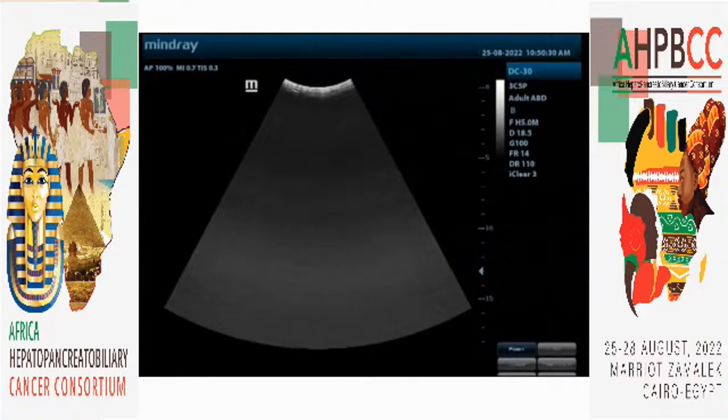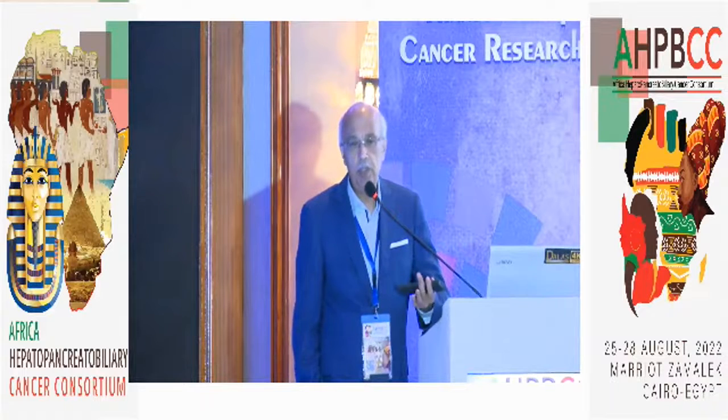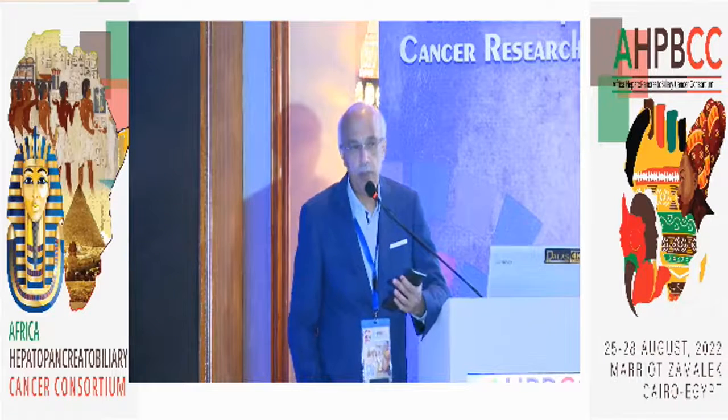So I think this session showed the exact value of the ultrasound, how it is an easy way of imaging. One of its benefits is that it is non-invasive, repeatable, and relatively cheap compared to other imaging modalities.